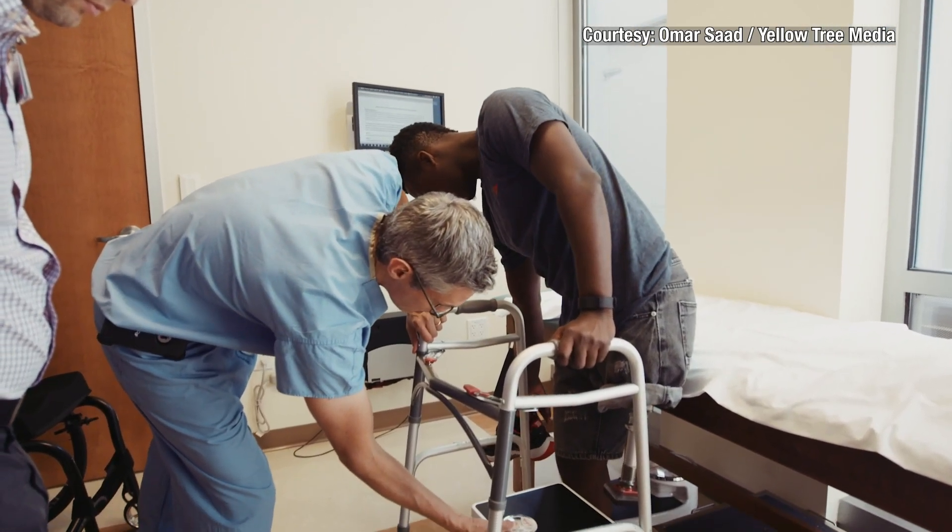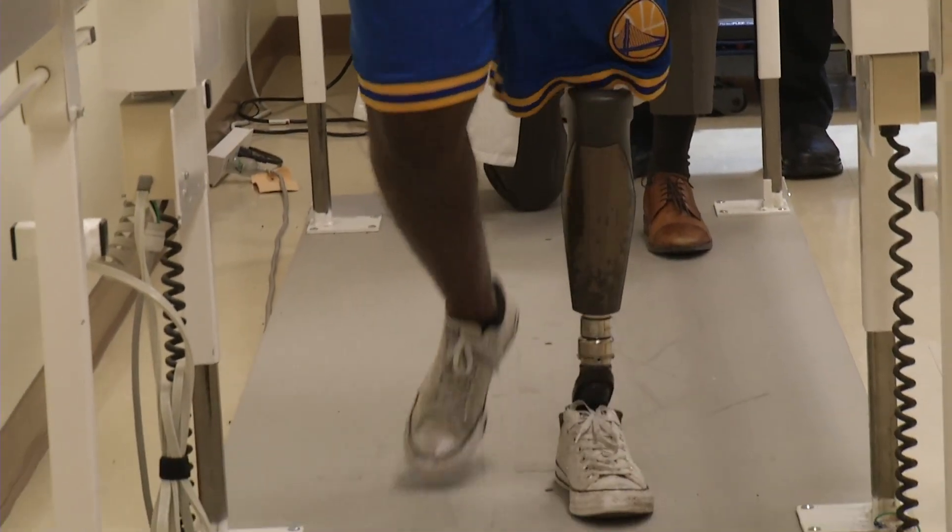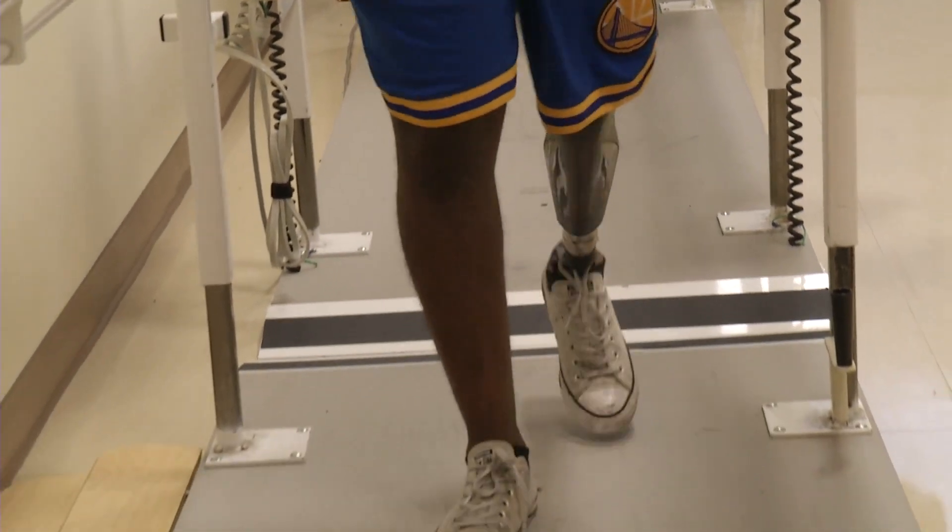That's followed by a fitting for a short prosthetic. Essentially what we had to do was relearn how to stand on my knees. After six short weeks, Munya received his permanent prosthetic. It makes it a lot more easy.